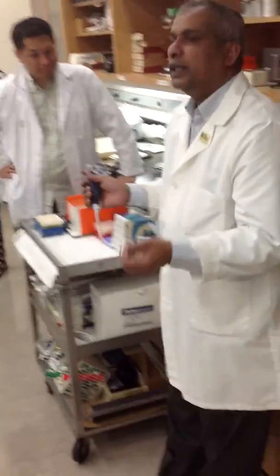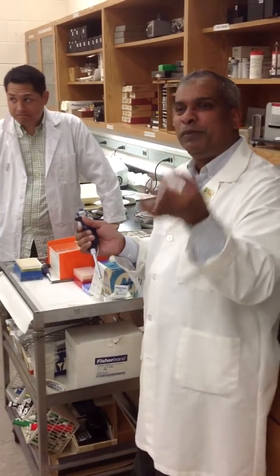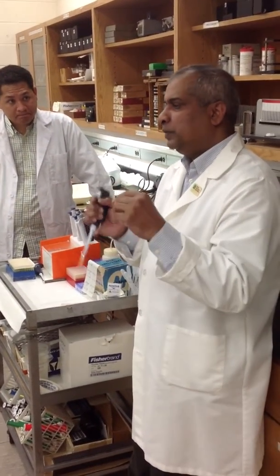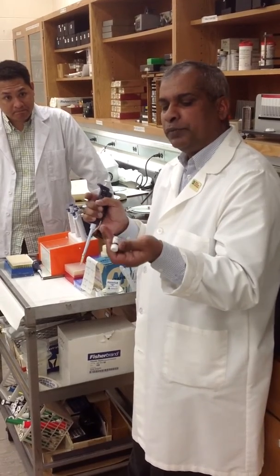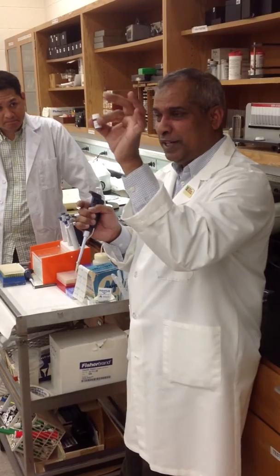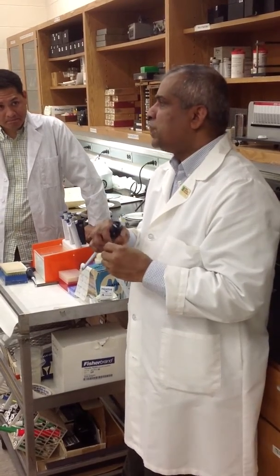It's slightly different from real blood because it's commercial blood. So you'll see we'll do a finger stick on someone next time, and so you'll see the difference from this to that. But the cells are very obvious.